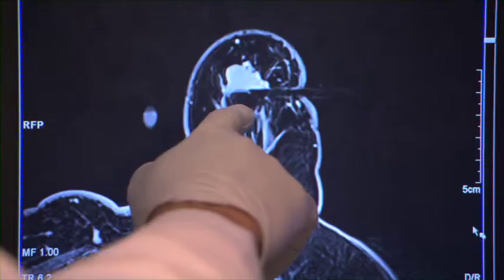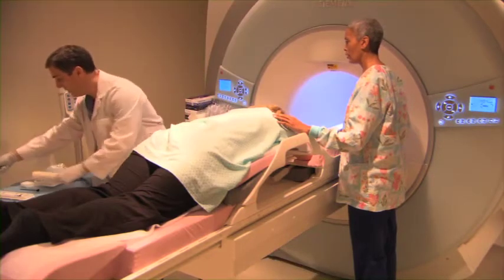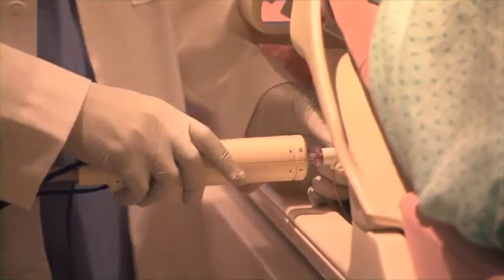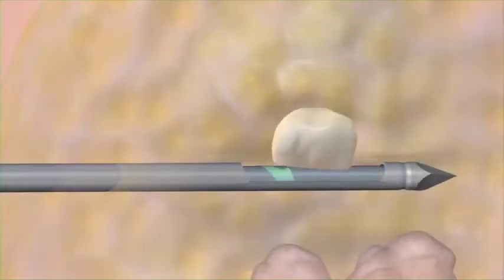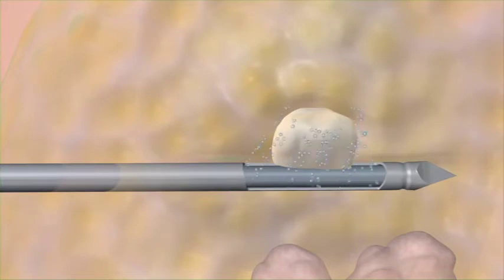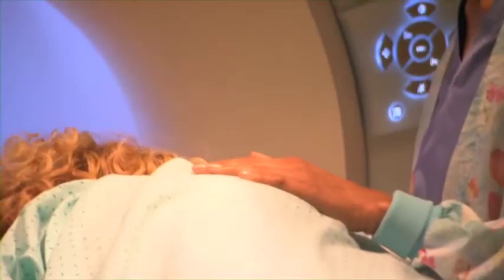At this point, the physician has targeted the precise point in the breast where the biopsy needs to be taken and positions the biopsy device to take the tissue sample. When the physician begins the biopsy, you'll hear a sound, and you may feel some pressure. Vacuum pressure is used to take out the sample, flushing the area with fluid at the same time. They take a few samples to make sure they have enough tissue for diagnosis. This could take a minute or 2. You'll hear a beep as each sample is taken.